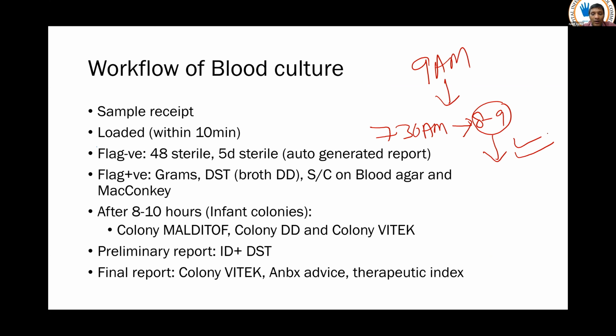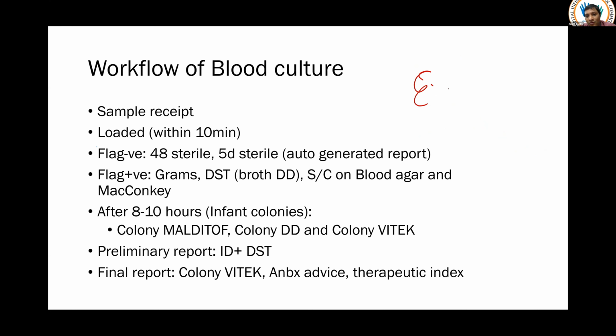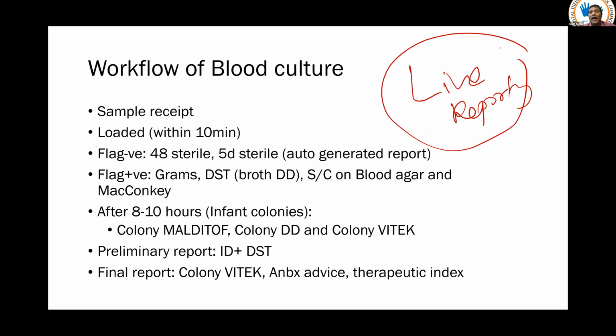So our reports usually get generated, and go to the clinician's mobile before they start the round. This is one time of reporting. Then again we do an evening reporting at 4 to 5 p.m., where we give the second stage reporting. And after the evening reporting, we also do something called live reporting. Live reporting was a concept I dreamt of when Dipasri was there, but I could not implement it at that time. However, after she left, Harita joined, and the software was in place. After the software was in place, we started doing live reporting.